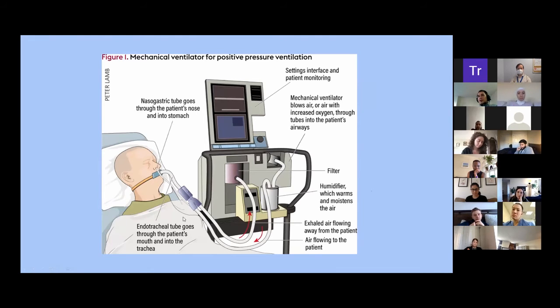Start all the way from the patient and work yourself back to the ventilator. Remember that the ventilator has two large pipes that are the inhalatory and exhalatory ports. The inhalatory port always goes through a humidifier. Pay attention next time you see a ventilator, there's this mini thermos connected to it. That's the humidifier. Okay, who's doing the next case?